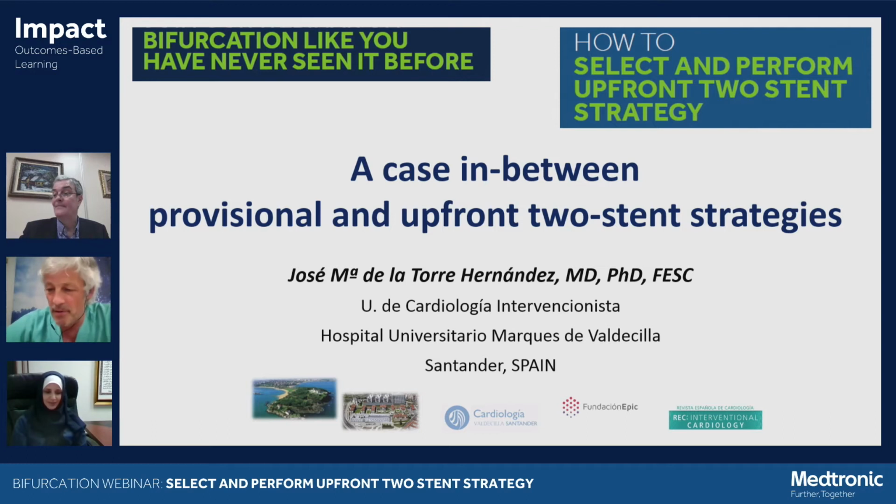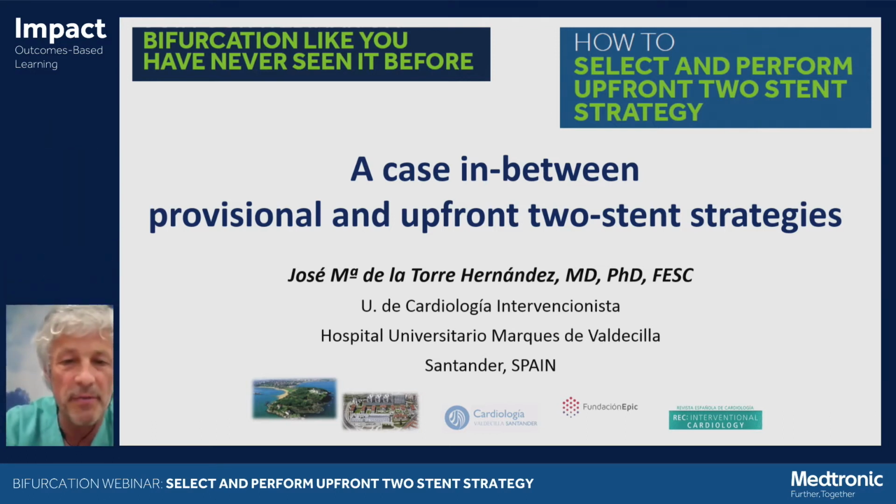Okay, thank you, Goran. It's a pleasure to be with you, with Mirvat. Just one question, Mirvat. Do you think that any stent is suitable for the DK crush? Do you think that there are differences between platforms? I think, again, you need to know what your cath lab carries and what diameters, and you need to see how far they expand. For example, the Onyx stent is actually very expandable. If there's too much of a size discrepancy between the left main and the LAD, what you can do is start with a 3.0 for the LAD, but then post-dilate to a 4.5 once you're in the left main.